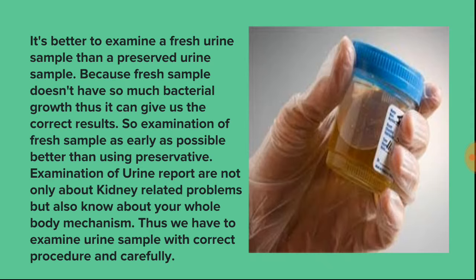It is better to examine a fresh urine sample than a preserved urine sample, because a fresh sample does not have so much bacterial growth and can give us the correct result. So examination of the fresh sample as early as possible is better than using a preservative. Urine reports are not only about kidney related problems but also tell about your whole body mechanism. Thus, we have to examine the urine sample with the correct procedure and carefully.